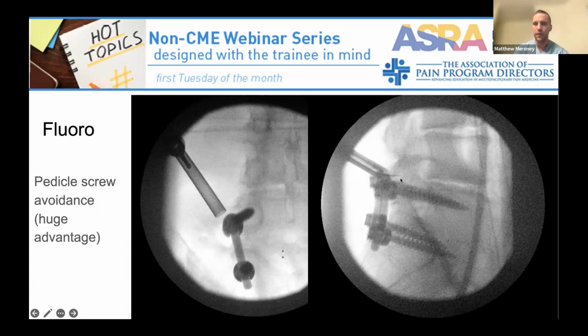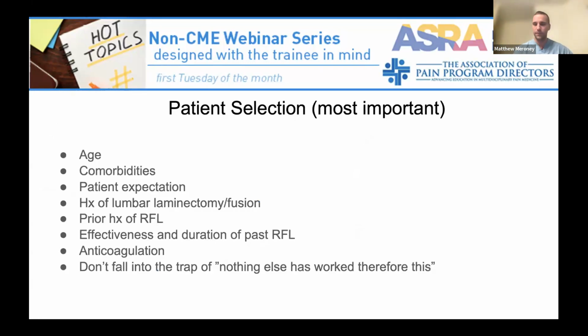So it looks like on lateral. Again, we're not going to the level of the neuroforamen. But this is one of the big reasons that this procedure has such an advantage, because you can bring your tools to the level of the pedicle screw, and you can dodge anything you need to do. I could see the Phillips head, access the pedicle screw, and I could unscrew it if I wanted to attempt to do that.